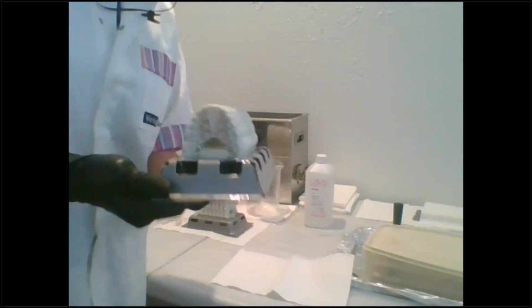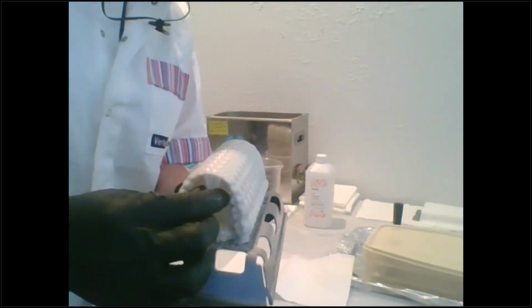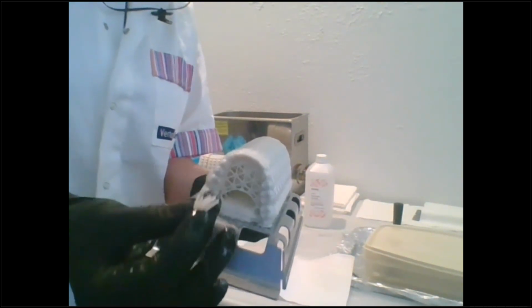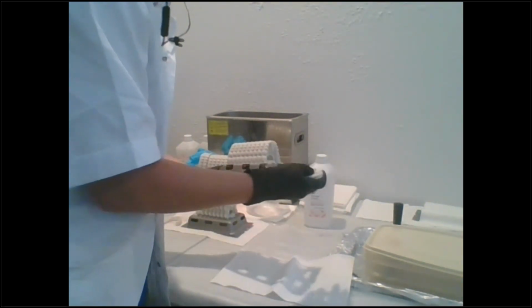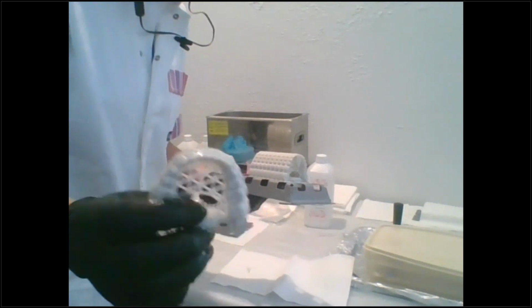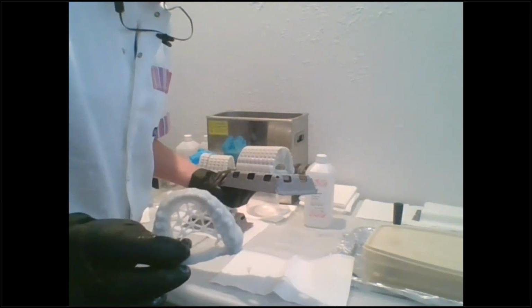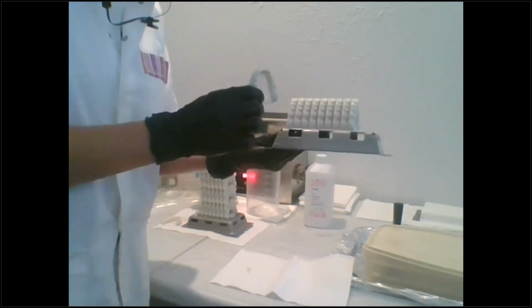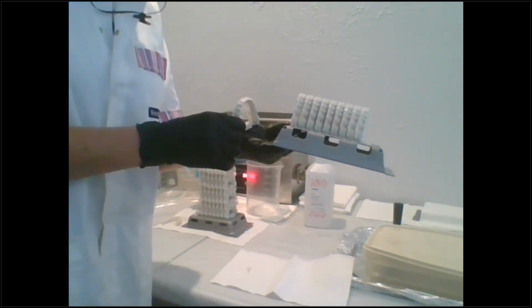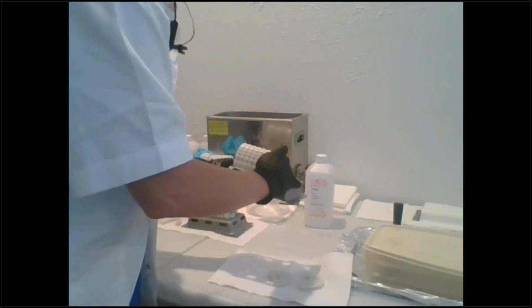So what you're going to do now is we're going to start with this guy, and you can see that those lingual supports here, they just peel right off. So you can just take off all of your arches. Okay, you can see that little stand I was telling you about. So if this was the full arch, the full stack, they would just sit real nice in your cure oven. So basically, you're just going to pull these guys off.